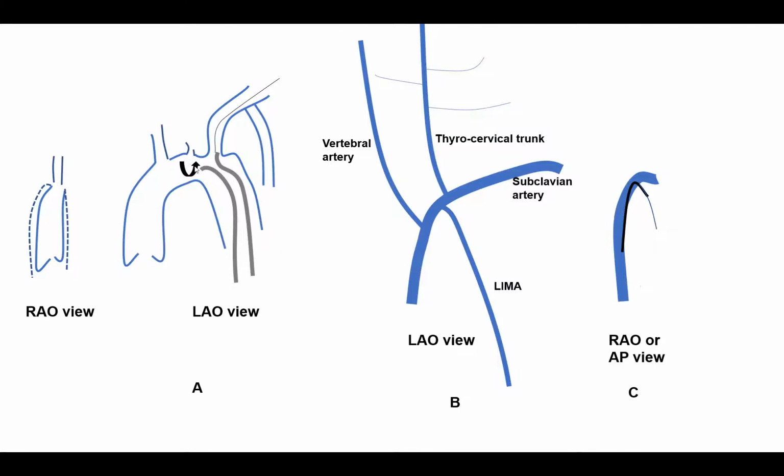So what I do, let's say you pull with a counterclock and you fall here. You reverse it, you clock to make that catheter fall back down in the aorta. Then you pull back again with a counterclock to make it look up into the left subclavian. So you reverse it and you pull back with a counterclock. What you can do is reverse it, push it, basically start it over, push it down till here, and pull a little more than you did initially with a counterclock to make it fall here.